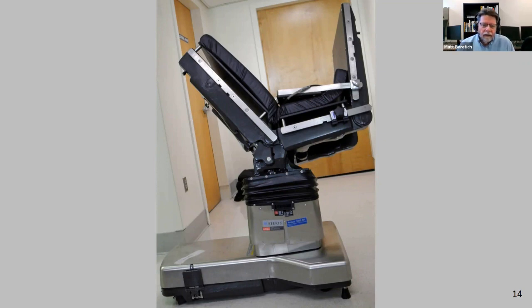And the table continued to move until it was in this configuration where the foot end of the table folded up all the way to the mechanical stop, and the head folded up all the way to the mechanical stop, and it tipped over away from us in this particular screen. And you can imagine that the immediate concern was to take care of that patient who was experiencing this. And it's a long story, and maybe you can invite me back for another GCEA talk, and I can go into it in some more.